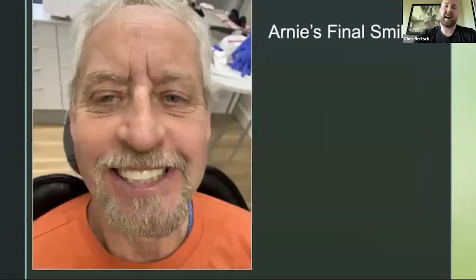So there's this final smile. Yeah, I'm really happy with it. He was really happy with it. The midline's much better, and the size and shape of the teeth I'm much happier with. So yeah.